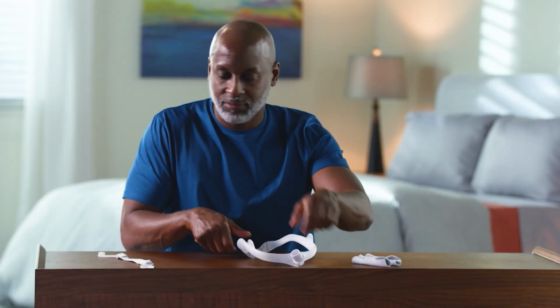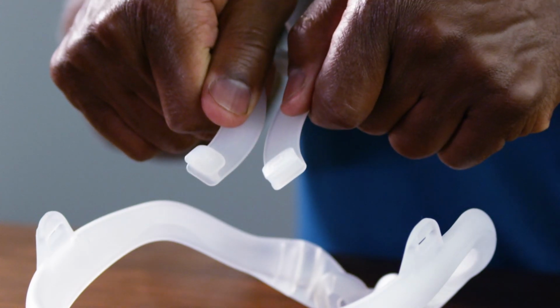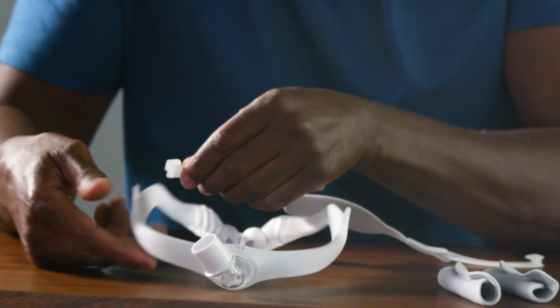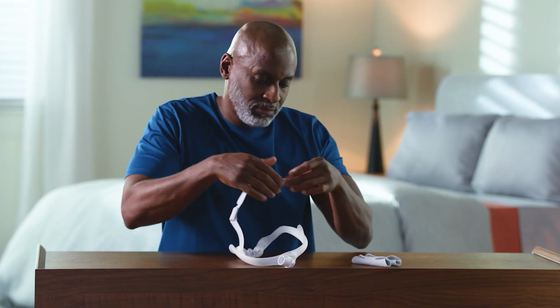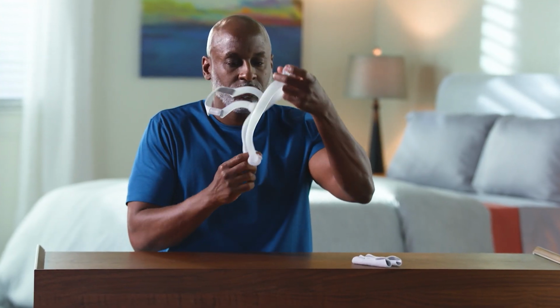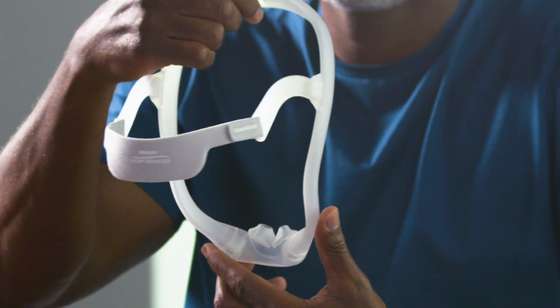To add the headgear, position the mask with the cushion facing forward. Look for the R and L symbols on the headgear arms. Push the R headgear clip through the mask frame loop on the right and the L clip on the left. When you're done, the R and L symbols should face outwards. The Philips Respironics logo should be on the outside facing up and DreamWear logo on the right.